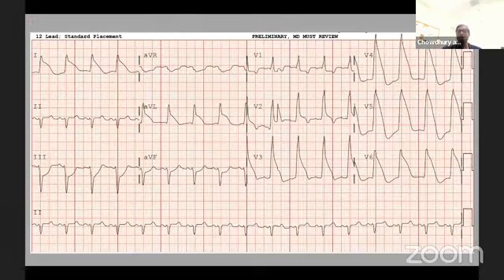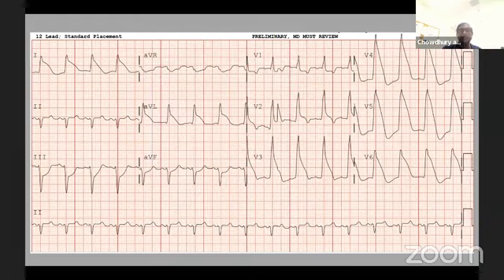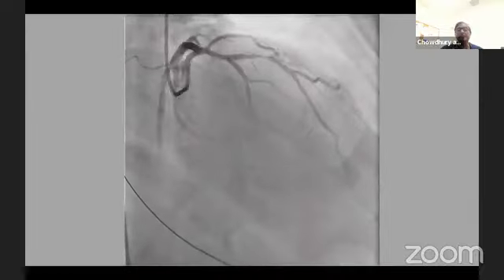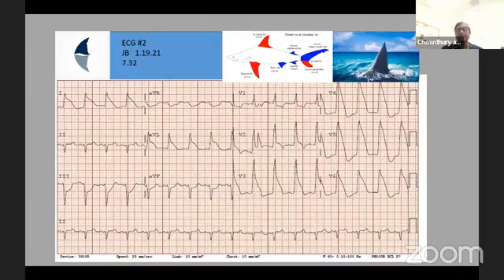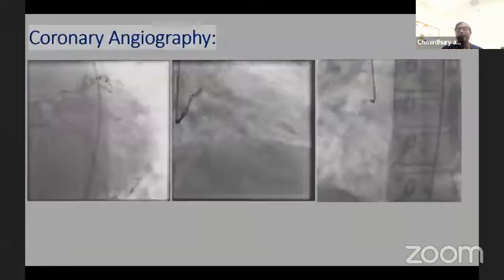Another type of EKG change, what we call the shark fin. These are very bad prognostic patients and sometimes can be compounded by critical care illness. Prognosis is universally bad. We have published on this, and you need to be careful about what we can do in these patients in terms of bad LV, multiple coronaries, metabolic acidosis, sometimes bowel ischemia. All these can be a confounding factor.